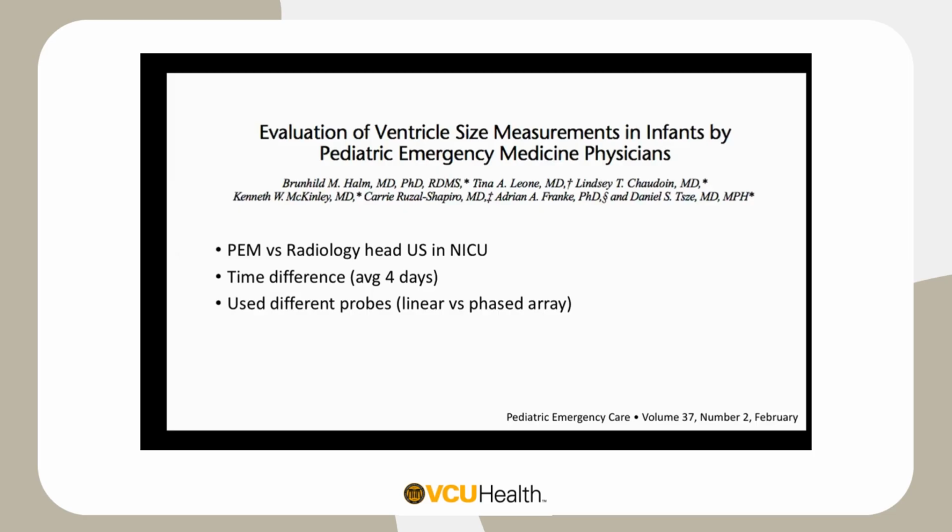So they've also done studies where they looked at pediatric emergency medicine physicians and radiologists looking at head ultrasounds in the NICU. But I found that this is not as helpful because they're so good in the NICU. So I probably would just leave it for the NICU physicians as well as the technicians who do this on a regular basis.